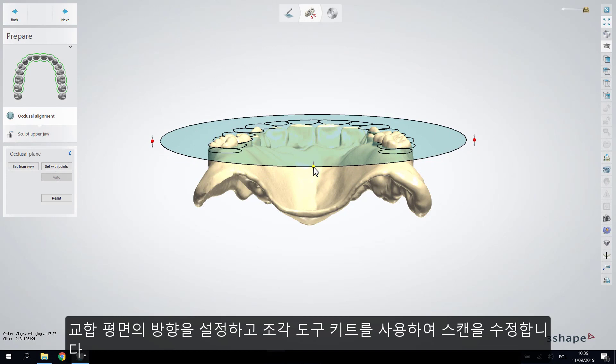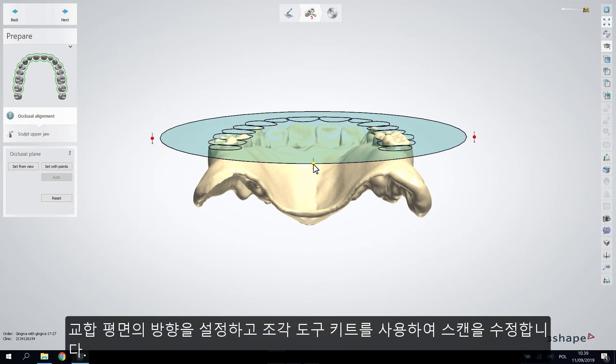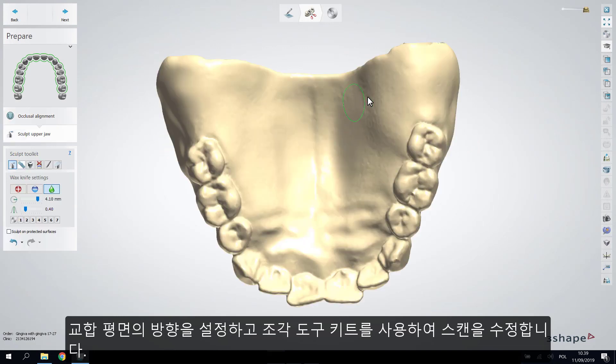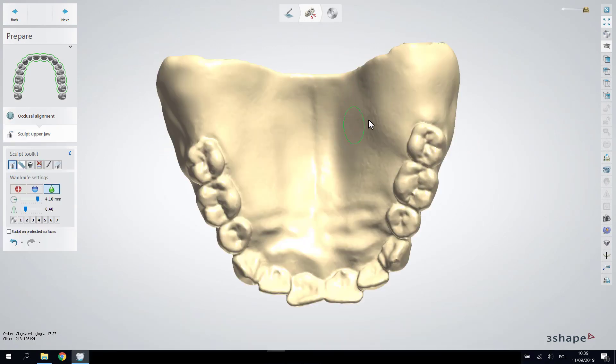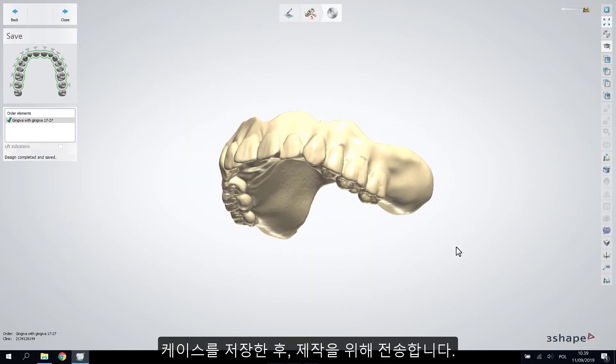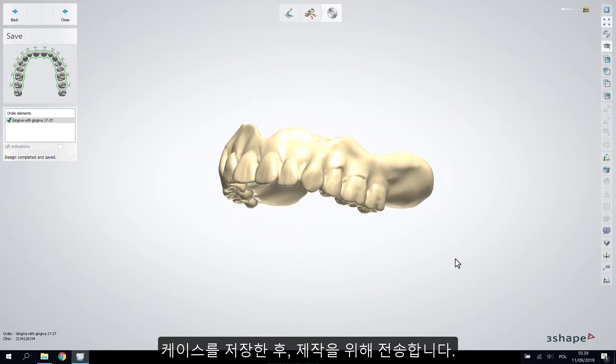Orient the occlusal plane and make any adjustments with the Sculpt Toolkit. Save the case and send it for manufacturing.